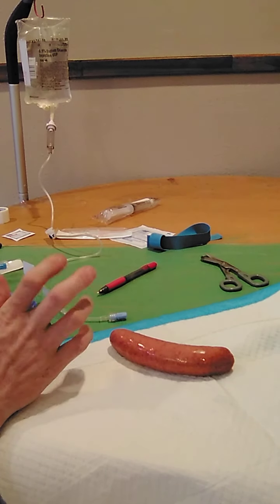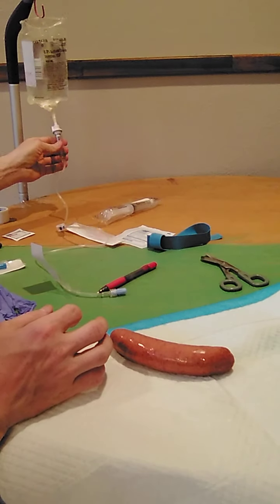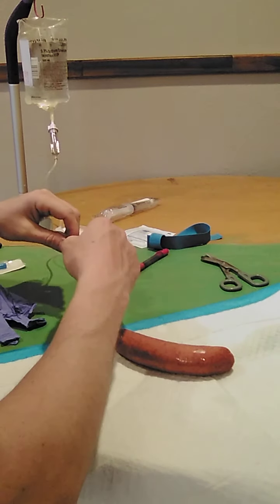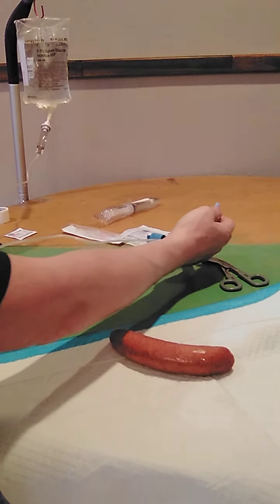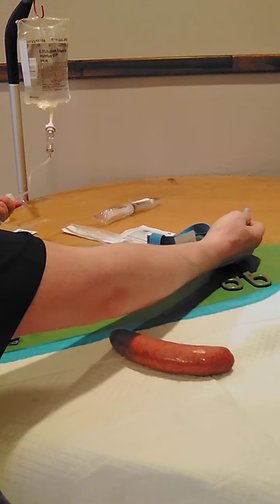So I'm going to prime this administration set. I want to see this about half full of its infusion solution. And that's been achieved now. Now I'm going to prime this solution to evacuate it of air. Okay, and that went really well.